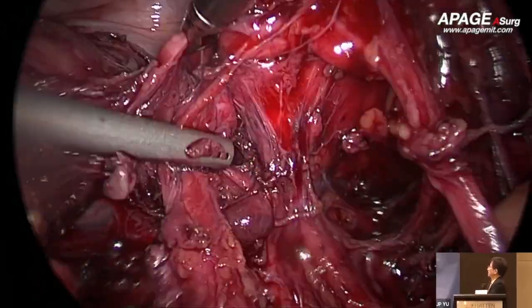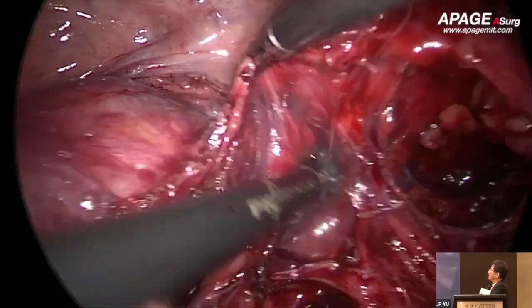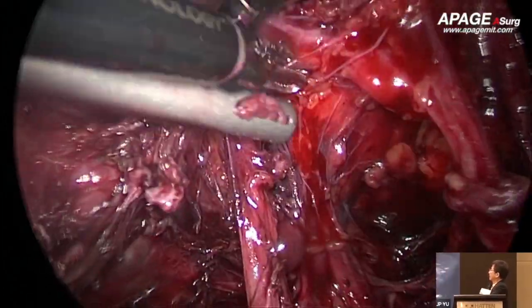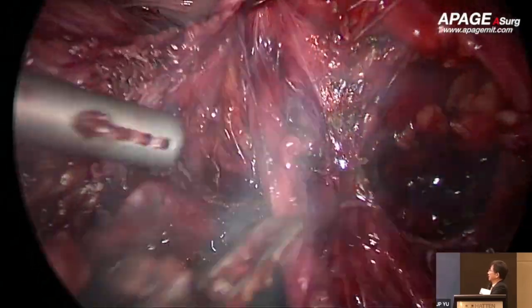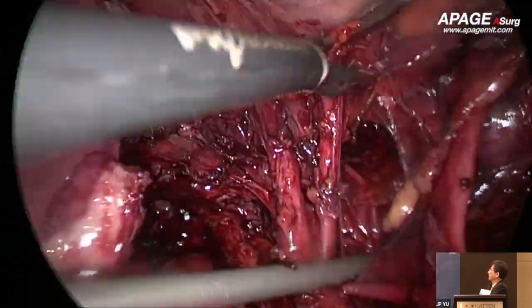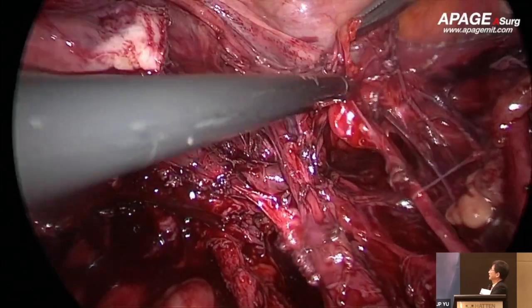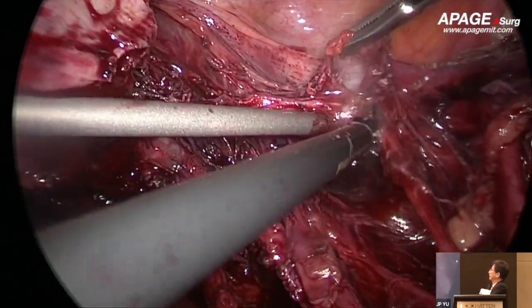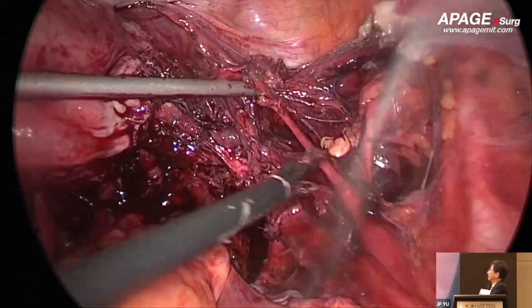The procedure during deep endometriosis is a little bit different from here. When we have identified the ureter in deep endometriosis, if there is no bladder involvement, then anteriorly we would not dissect a lot. But in the radical hysterectomy for cervical cancer, we should identify it all.